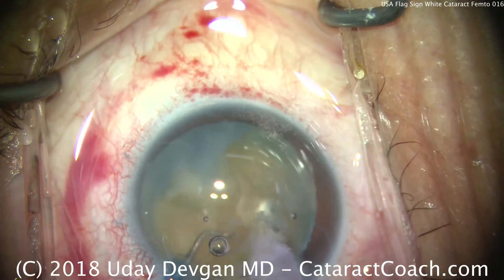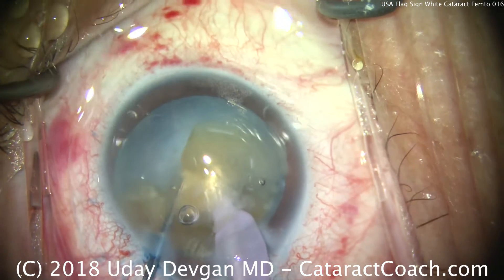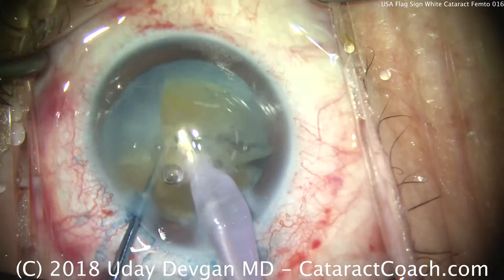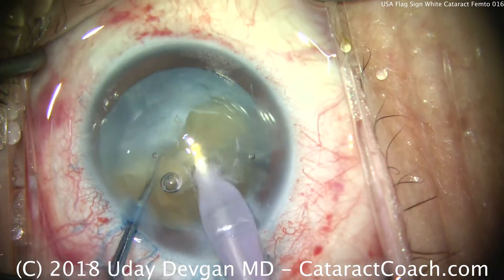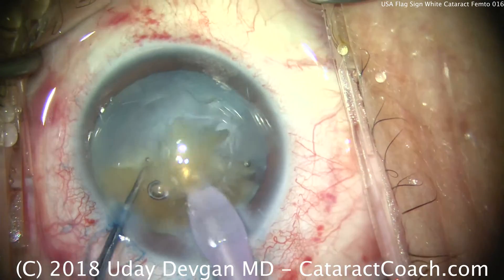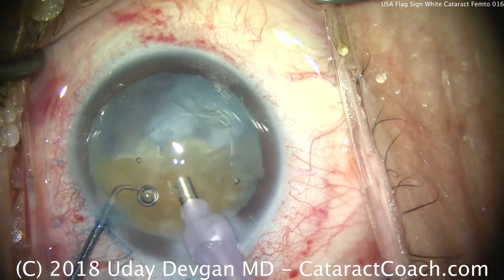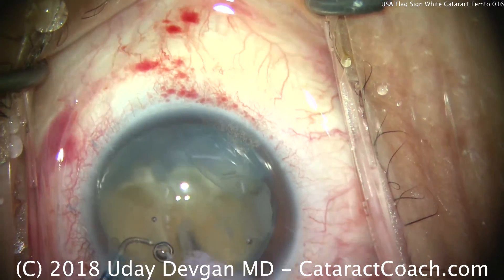But we did not have any issues with the capsule radializing, because we used the femtosecond laser in a closed eye, in a closed chamber. We're just doing chop technique here, and it requires quite a bit of chopping. This lens is relatively dense. You can see that coloring of the lens showing its density.